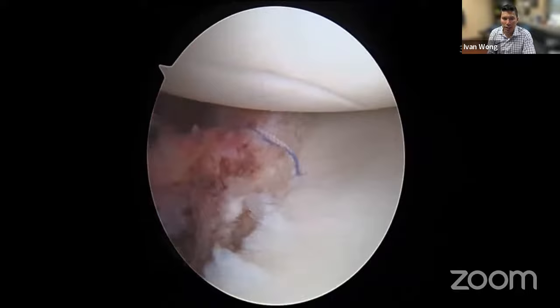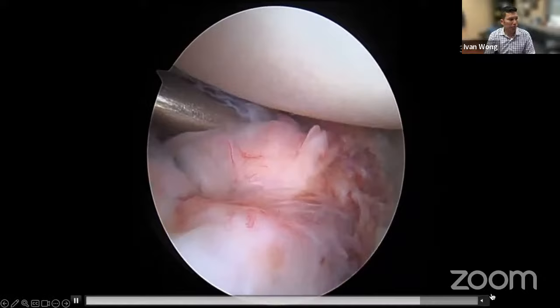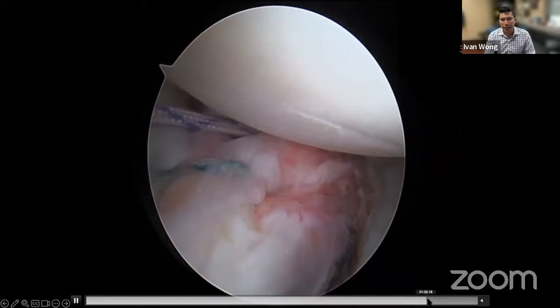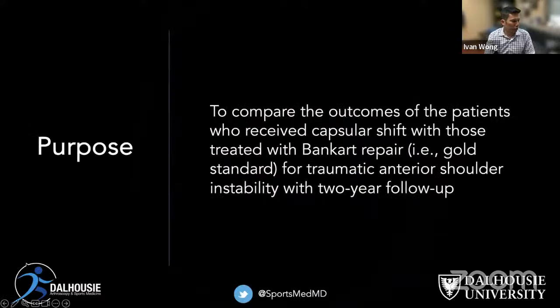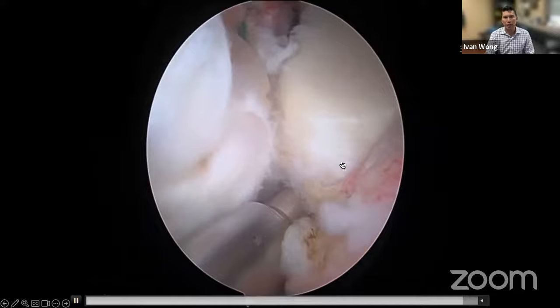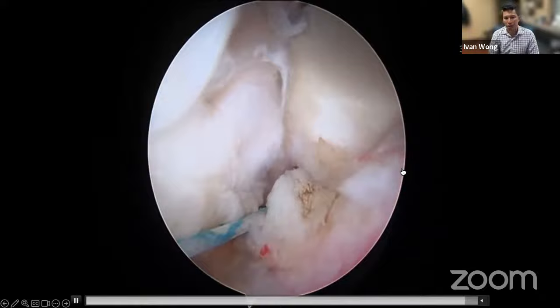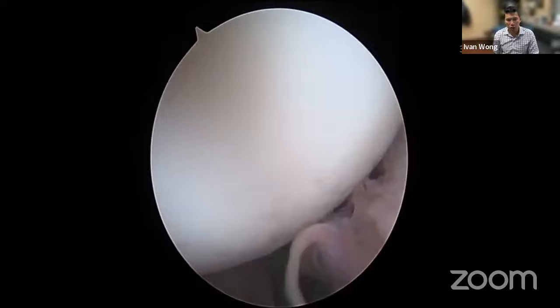After tying, we take the green traction suture and show how close we can get back to the 12 o'clock position. This is now 12 o'clock right here, with our last suture below and the green traction stitch right beside the biceps tendon. We've gotten the entire repair back to the 12 o'clock or just close to the 12 o'clock position — moving from the original three o'clock traction stitch all the way to 12 o'clock. Now we have the remplissage left to complete.